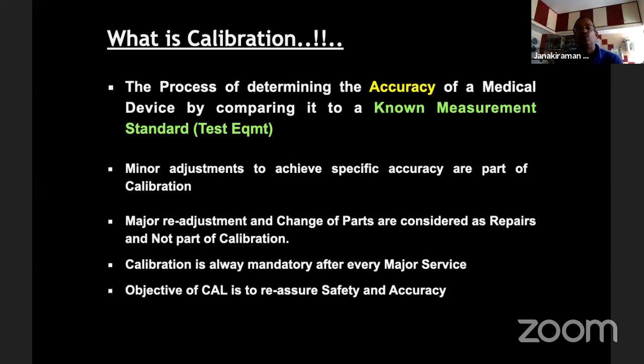Minor adjustments without opening the machine, without moving the machine, are part of the calibration. Okay, so not the major readjustment.